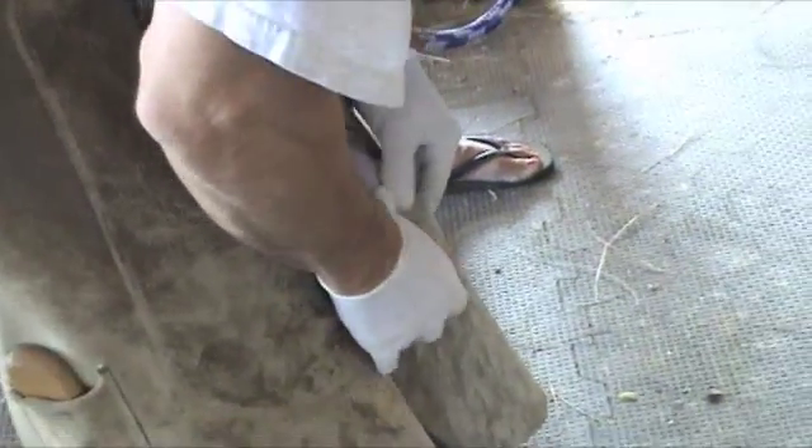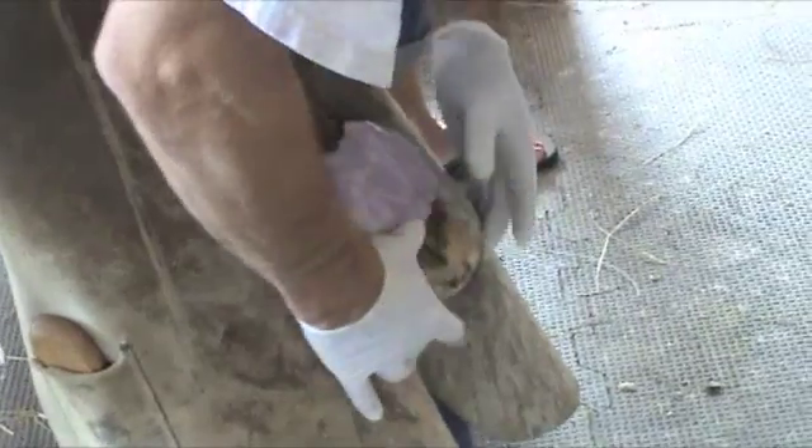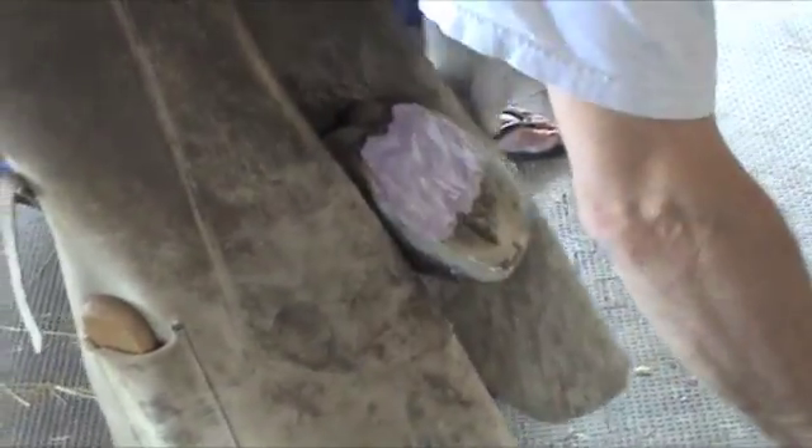It's real soft now but it becomes very cushiony for the horse. It's going to be underneath this pad.